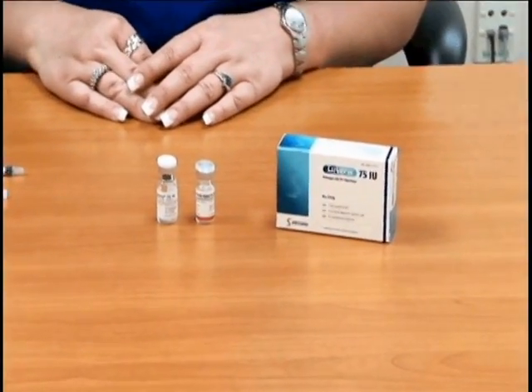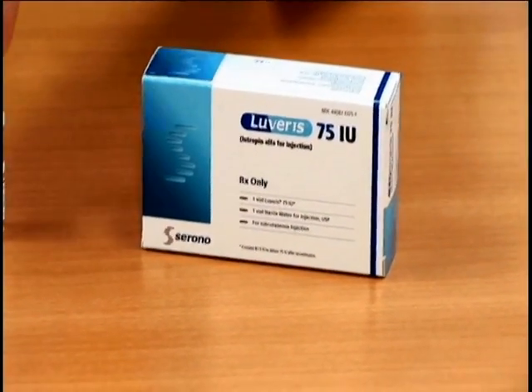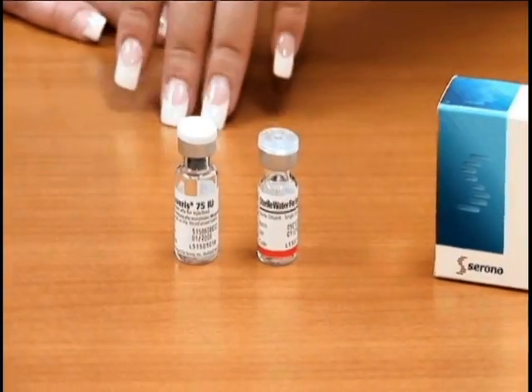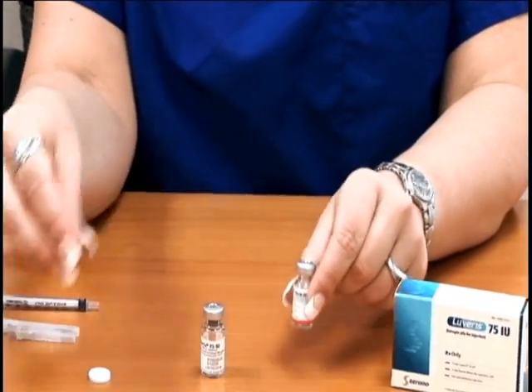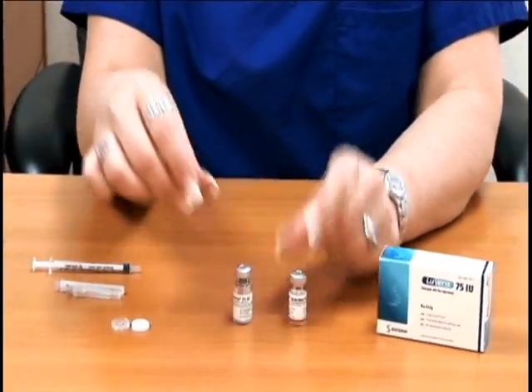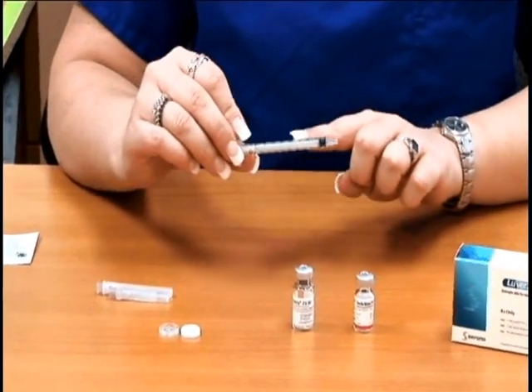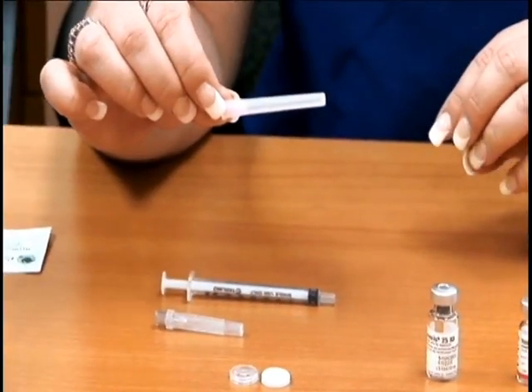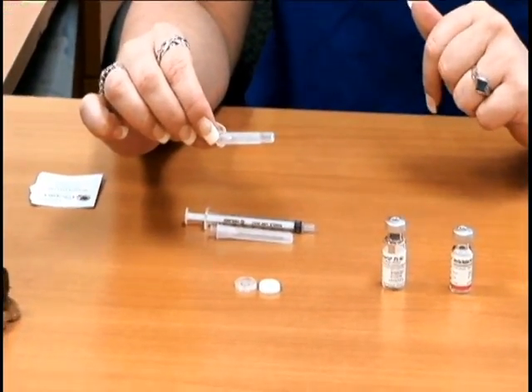Now we're going to show you how to mix and administer your Luvaris. In the Luvaris container you're going to receive one vial of liquid and one vial of powder. The first thing you want to do is take off the caps to the vials. In the medication order you should receive one ml syringes along with 18 gauge one and a half inch needles, as well as 27 gauge one and a half inch needles.